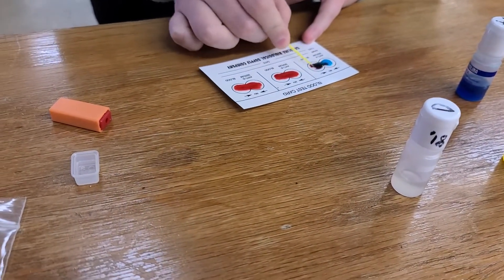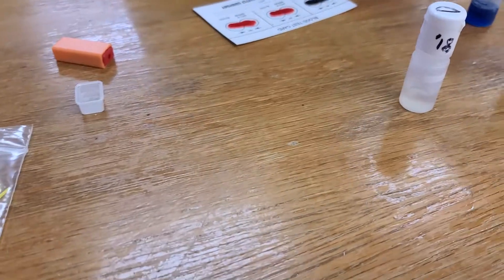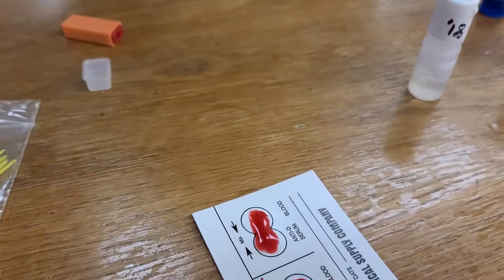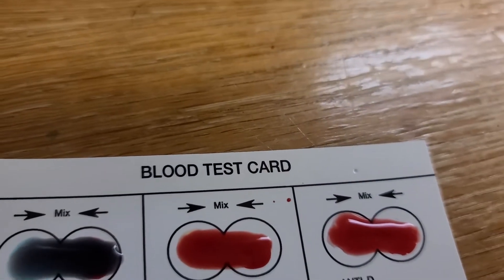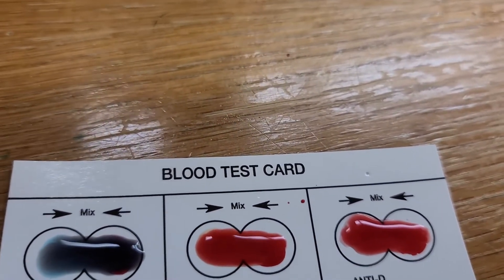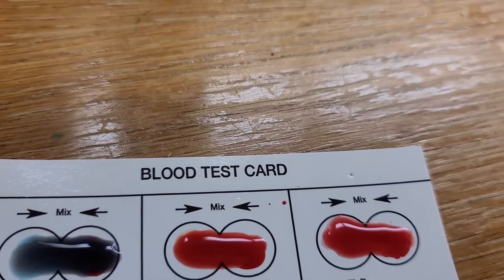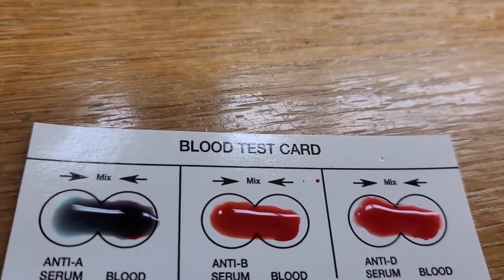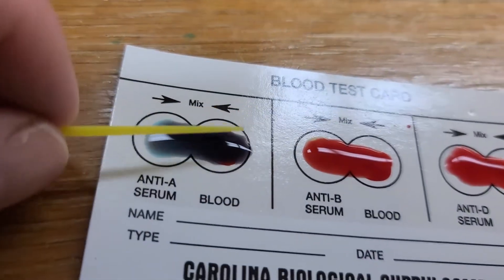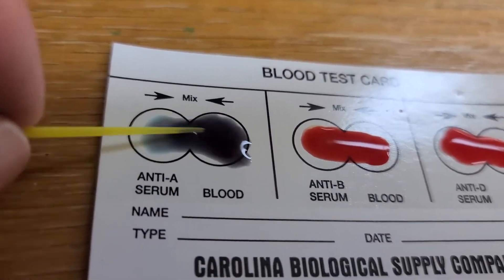You got like zero blood in this one, it's okay — you got it mixed up though. Now if you could bring the card over. Sometimes it helps to have a stick. It looks like A is clumping a little bit already. Sometimes it's a little hard to tell at first. What you're looking for is little dots in it — you can kind of see it, but maybe I'm imagining it.